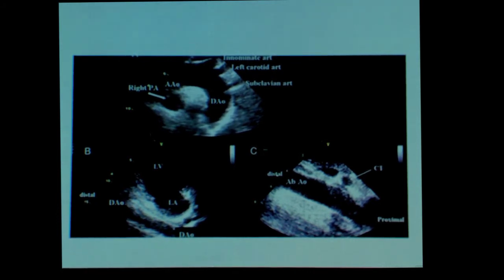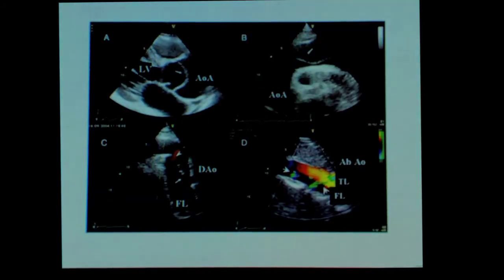Yeah. This is a flap, dilated aortic root, clearly a dissection, right? This is, sorry, double lumen seen in the arch, right? And in the descending aorta. So you can see it in multiple areas. And that top right view is still a suprasternal view, correct? Correct. It's quite obvious now, with angling toward the right a bit.